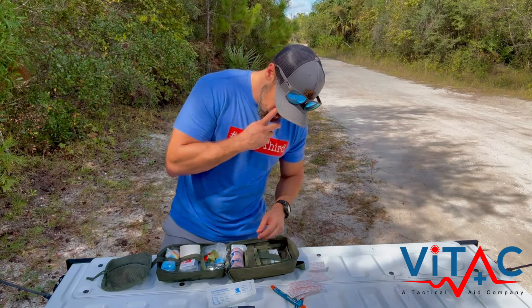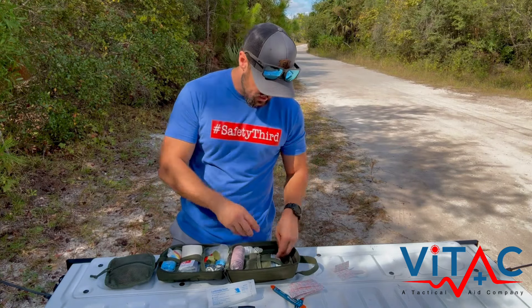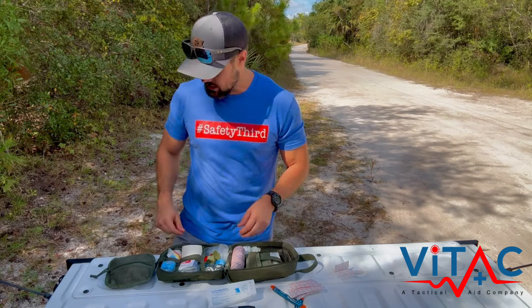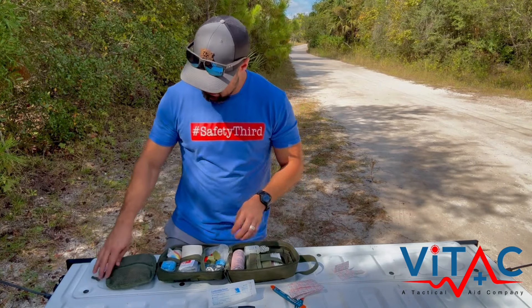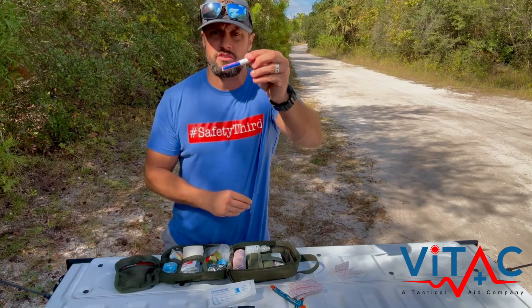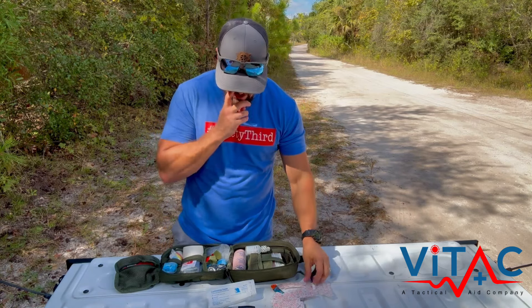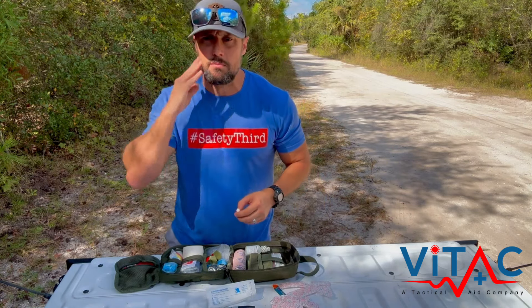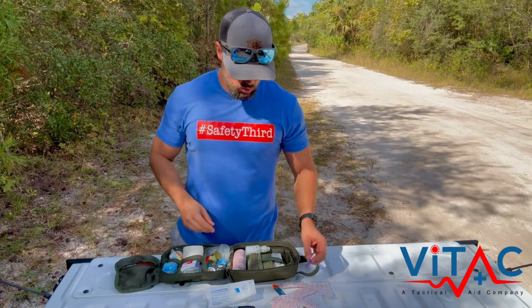You've got some butterflies and Steri-Strips for wound closures. In conjunction with those, you have liquid skin — it's a little blue bottle. That kind of goes together with your butterflies, because when you're using a butterfly, sometimes you need to use this. It's almost like super glue to help keep the wound closed.